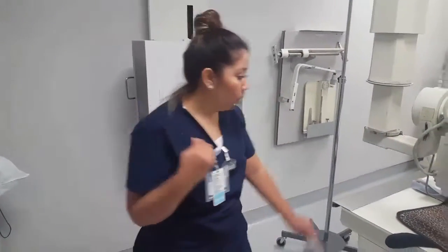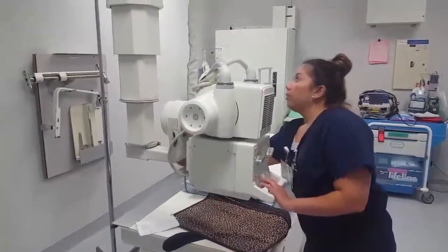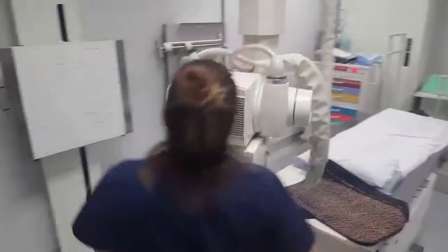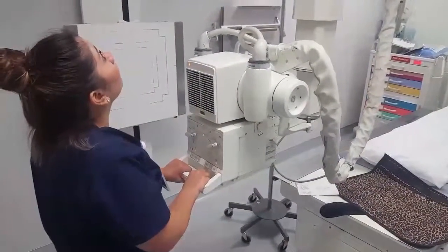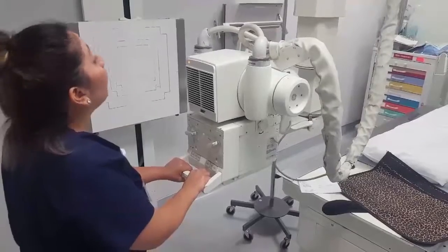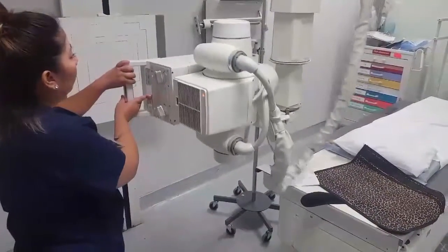But before getting my patient, I want to make sure I have my room set up. I have already set up my console to my wall bucky, and next I'll be detenting my x-ray tube to my wall bucky. I'm going to bring this around. Once I have that there, then I'll be angling my tube to a 90-degree angle.